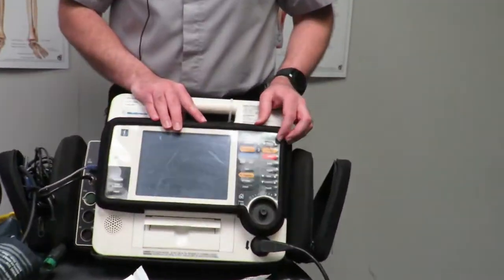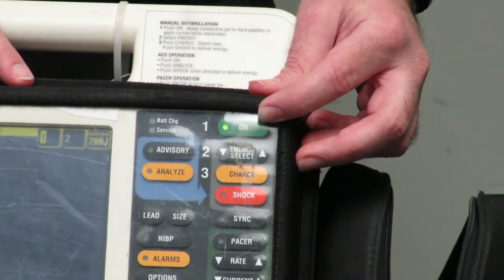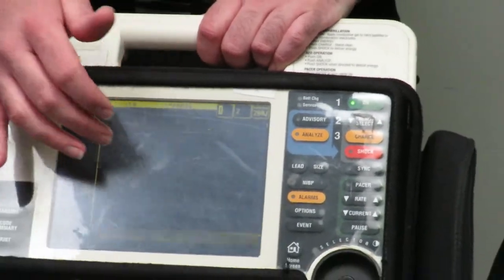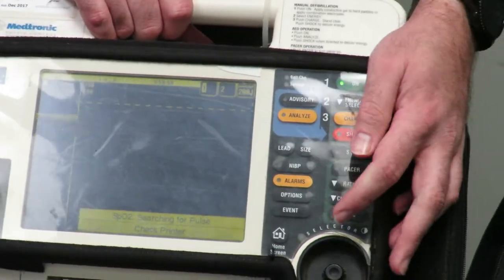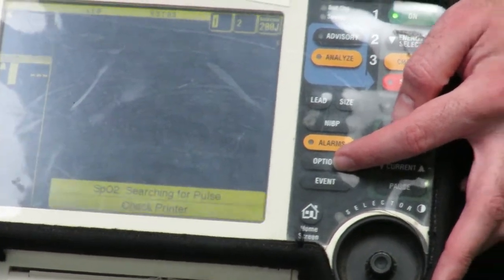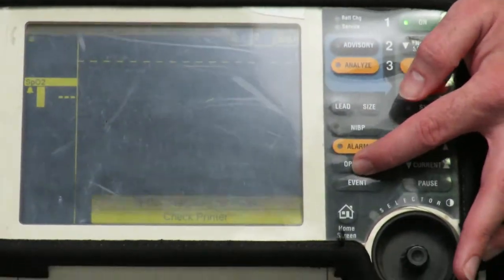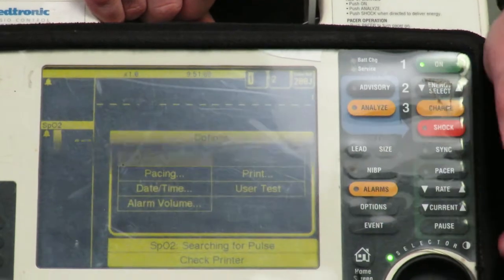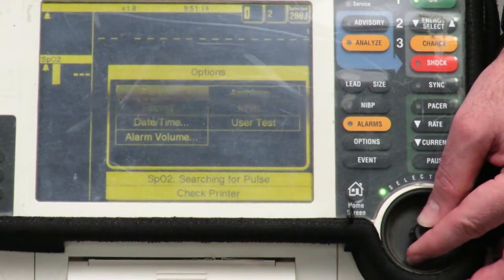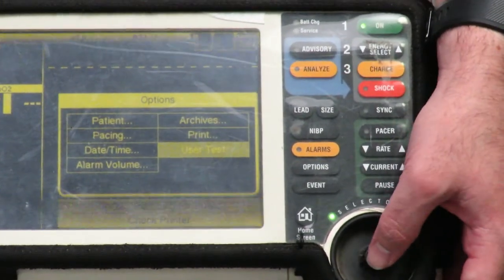The first test is known as a unit self-test. To initiate it, press the on button located in the top right corner labelled 'on.' That turns the unit on and you can see the details come up on the screen. You then press your options button, which is located under the alarms — the button setup is exactly the same on all four units. Press options, then using your scroll wheel scroll down to 'user test,' and to select that option simply press in on the wheel.